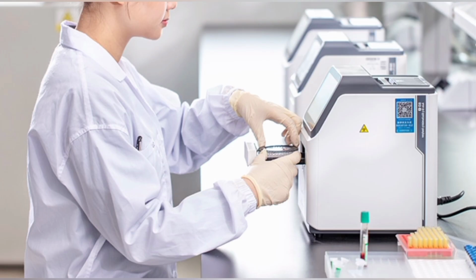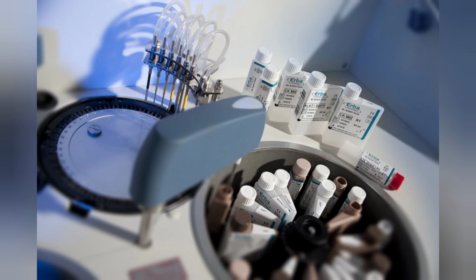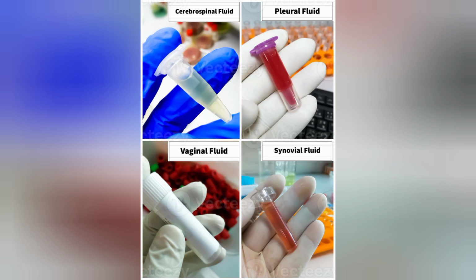Biochemical analyzer is used extensively in clinical laboratories. Its basic principle is to conduct tests to measure chemicals at various stages of the biological processes. It uses a wide range of test samples like blood, plasma, serum, cerebrospinal fluid, and urine.